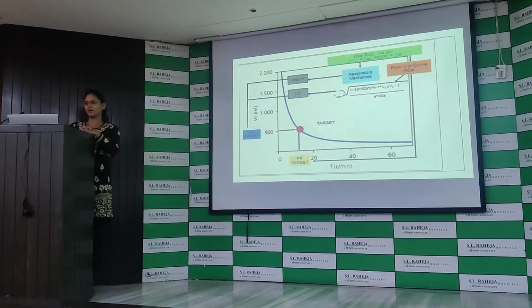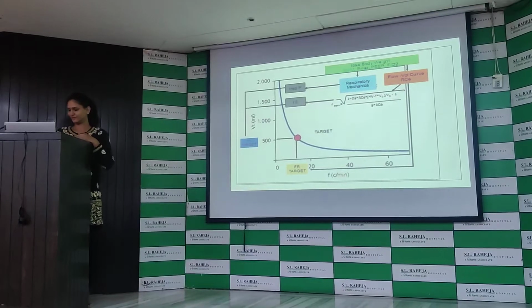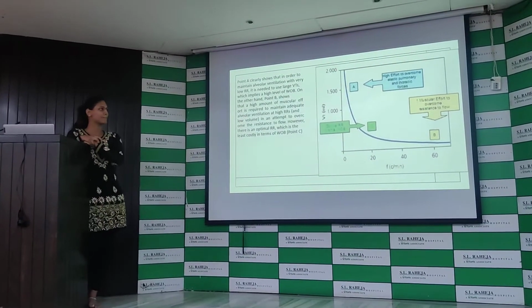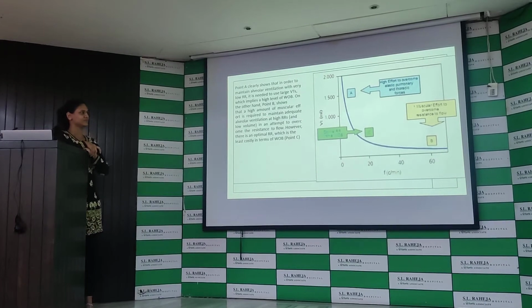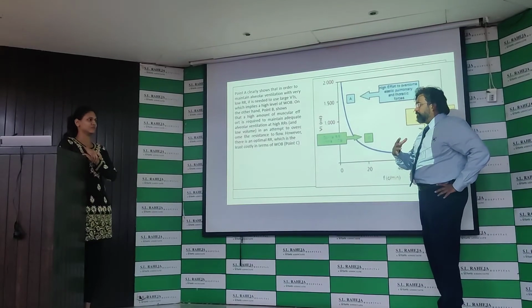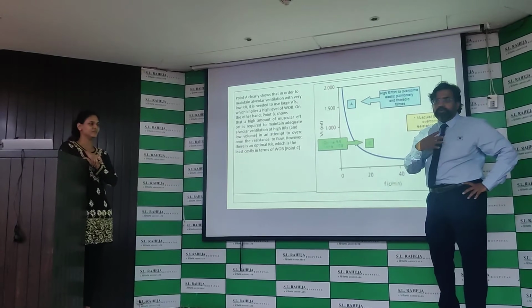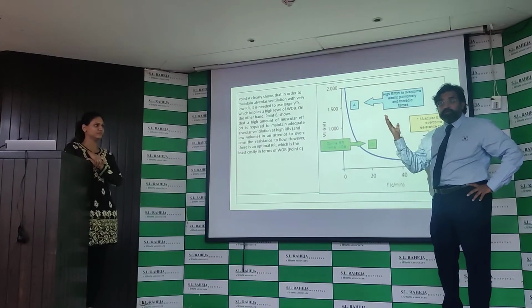Now, this is how the mode calculates. So let's go back to that. What you want to understand here is, when you are going to point A, what are you doing? You are giving volume to inflate the lung. So how much work does the patient require? The patient requires work to inflate the chest wall and inflate the lung. He has to do both. That's why the volumes required are high, and that's why the work is very high.